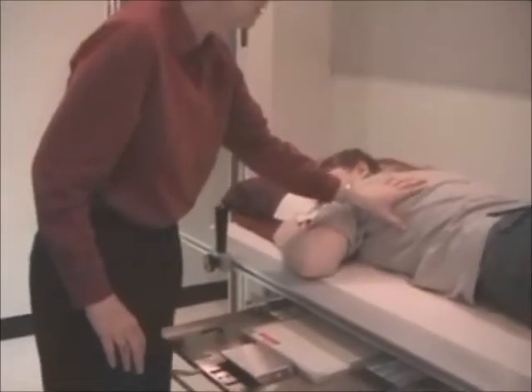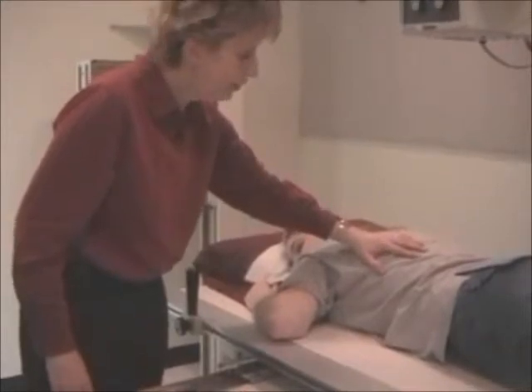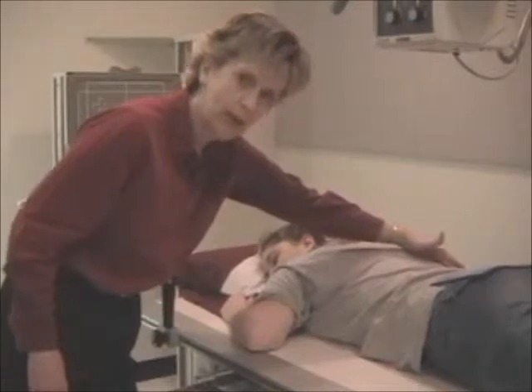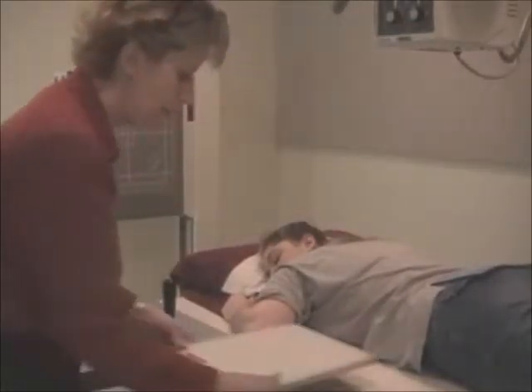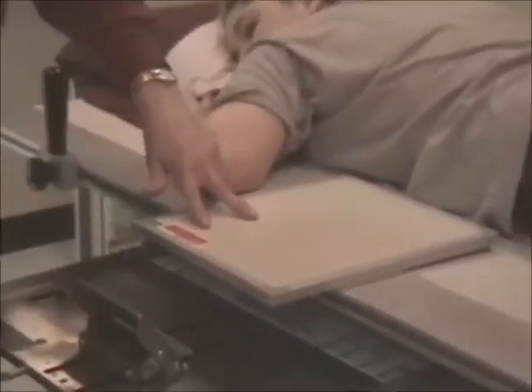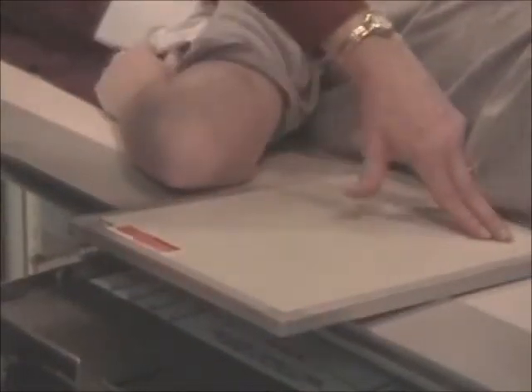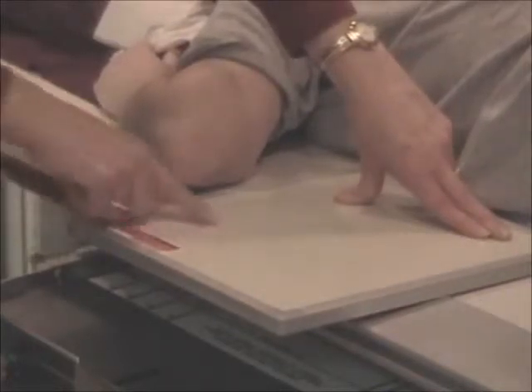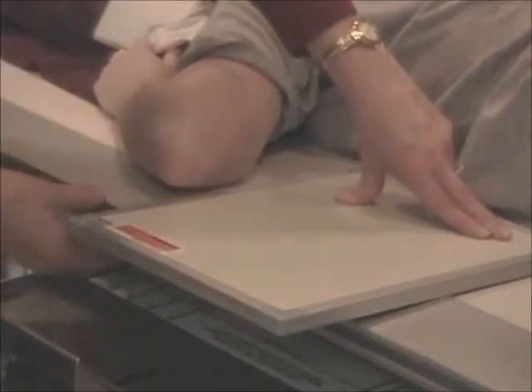And here's her left side. The fundus of the stomach would be here, and then the body and the pylorus come to the patient's right side. So if we track that on a film, I want you to look here for a second on the cassette. Fundus is on the left side, and it circles around into the body, and the pylorus ends up over here. So I'm looking at the ID blocker and I'm going, but it might be into the fundus. That's a true statement. It might be into the fundus.